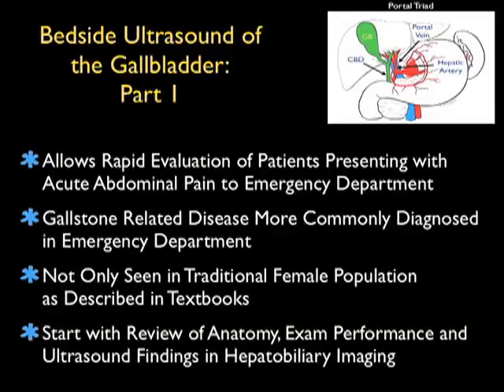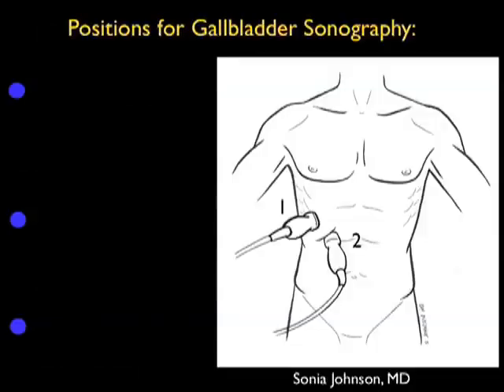So let's begin this module with a review of the anatomy of the right upper quadrant, how to perform the exam, and the ultrasound findings in hepatobiliary imaging. Let's begin with a review for the positions for gallbladder sonography.